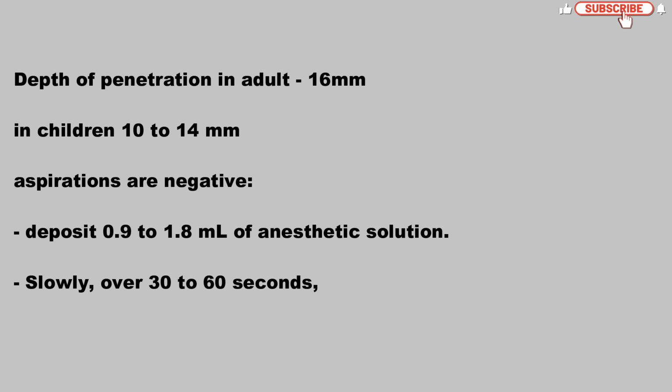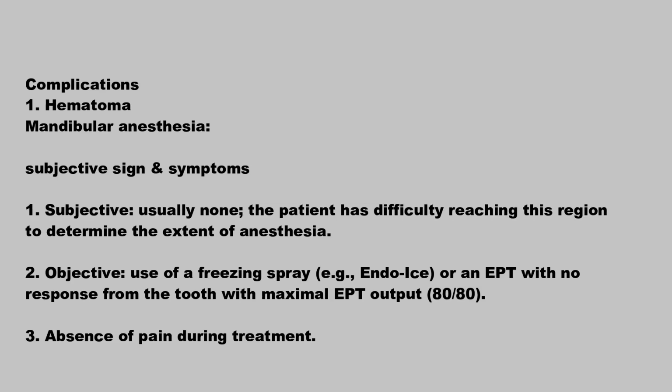Depth of penetration in adults is 16 millimeters. In children, 10 to 14 millimeters. If aspirations are negative, deposit 0.9 to 1.8 milliliters of anesthetic solution slowly over 30 to 60 seconds.